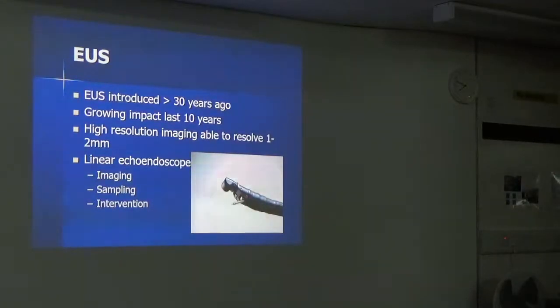So you can examine the liver from there, the bile ducts. We use it to see if there are any little stones that have been missed on other scans. Because you're putting the ultrasound inside the body, you get a much better picture than you can from outside, and in certain circumstances it's a better resolution than you can get with CT or with MR.